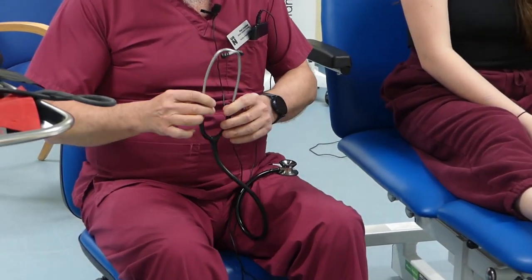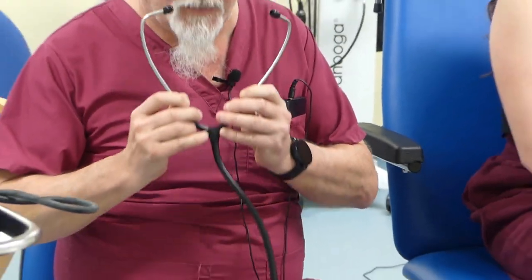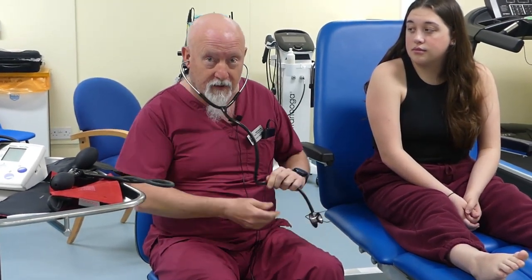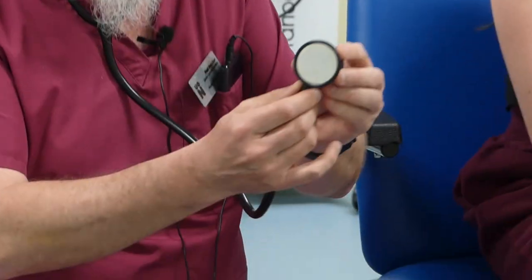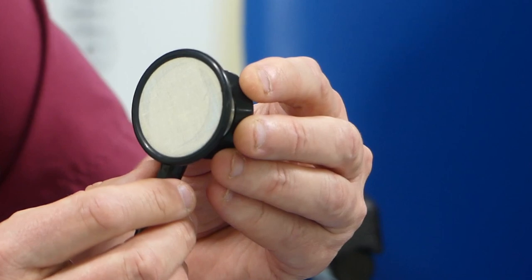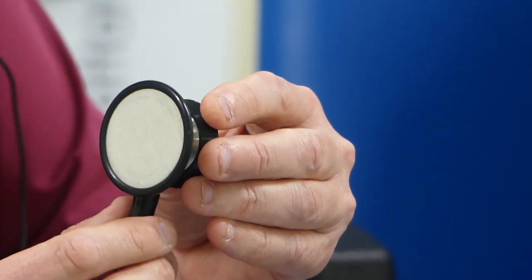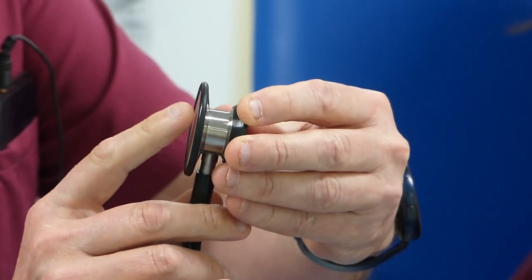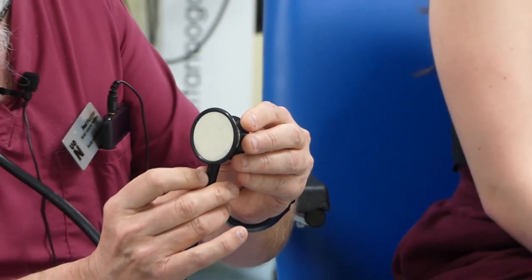When you put the stethoscope into your ears, the earpieces go forward and downwards into the ear sockets, not backwards. They fit in like this. Now if you touch the membrane when it's open, it'll be super loud in your ear — just a tiny touch and it'll be loud. If you twist it the opposite way, it turns the membrane off and it won't be loud. So you need to make sure that you've got it open and it's super loud.